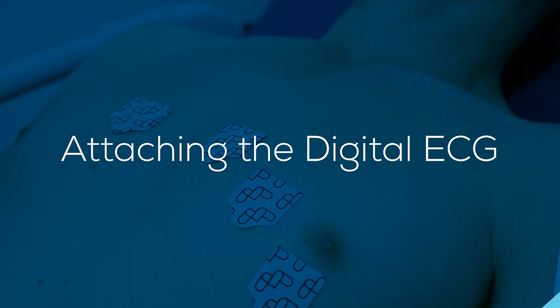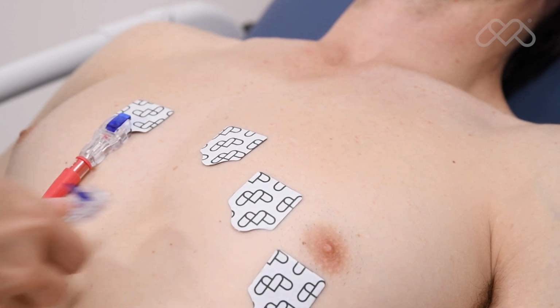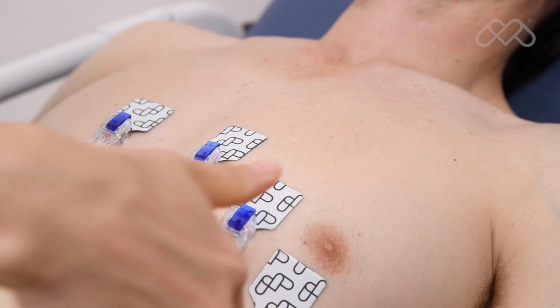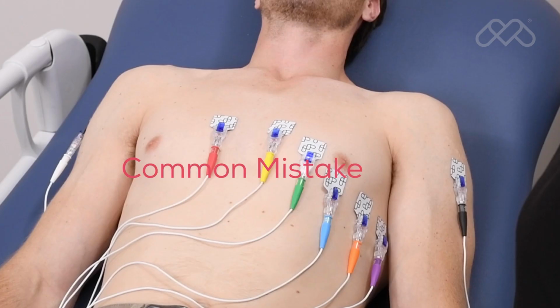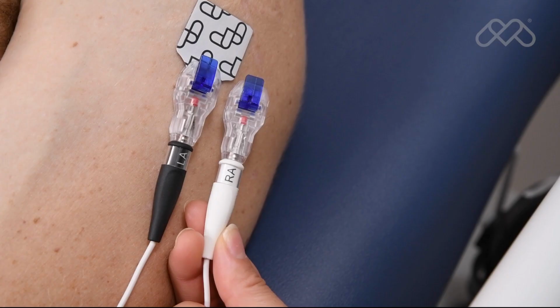Attaching the digital ECG. With the electrodes in place, attach the ECG clips from the patient cable to the electrodes in accordance with the lead labels or color codes at the end of the patient lead. A common mistake to avoid is switching the right and left leads. Please remember that the right and left designators on the patient cable refer to the patient's right and left.